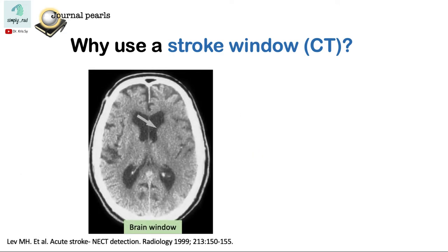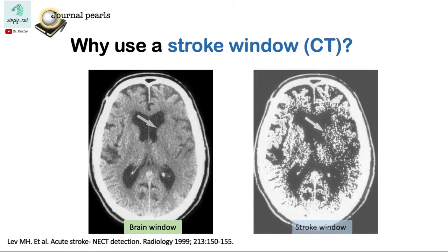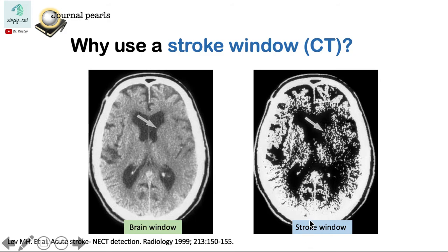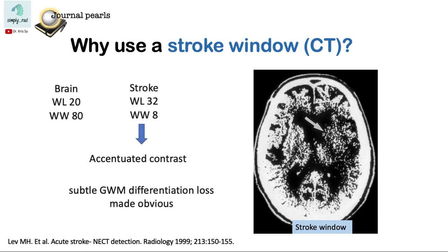So why use a stroke window? This is the brain window — the left caudate here appears normal. But when we adjust to a stroke window, there is now a much more obvious change in contrast. We note that there is a hypodense left caudate head compared to the contralateral side, as well as hypodensity in the operculum. A stroke window has a much more narrow window width, resulting in accentuated contrast, so subtle gray-white matter differentiation losses are now made more obvious.